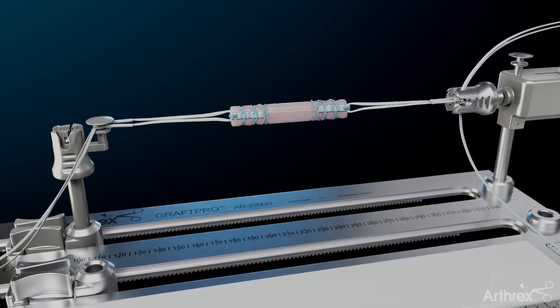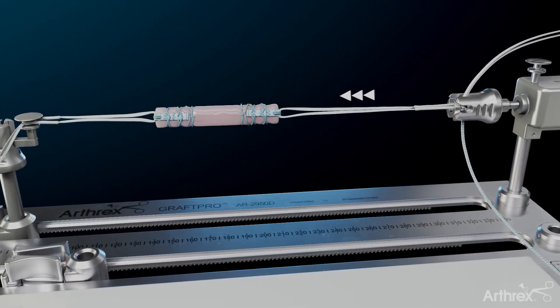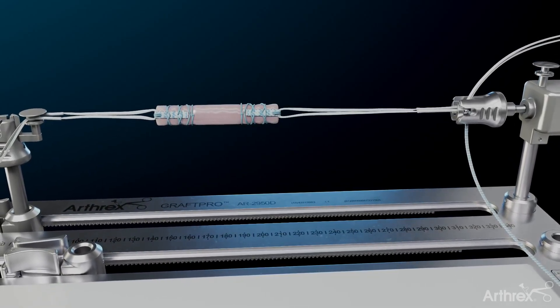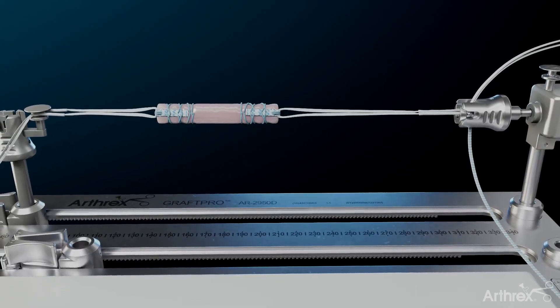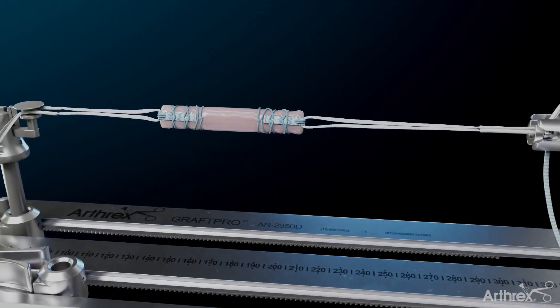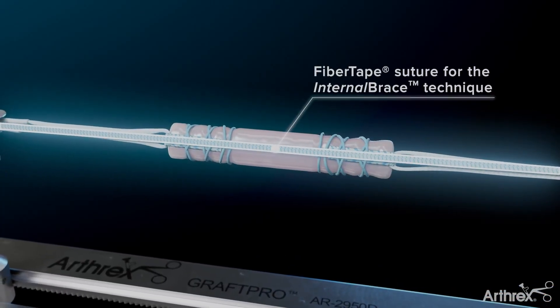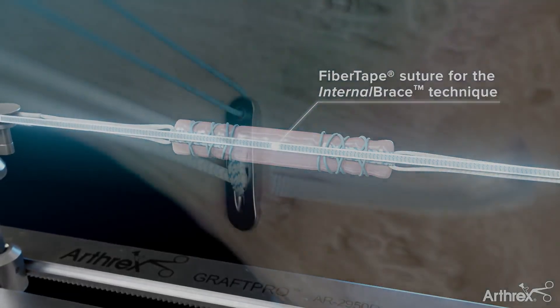On the back table, prepare the quad-link ACL graft. Elongate the femoral tightrope to ensure the quad-link ACL graft sits outside the joint after passing the femoral tightrope button. This positioning allows clear visualization of tunnel fill. The tightrope 2 implant is preloaded with fiber tape suture for the internal brace technique.